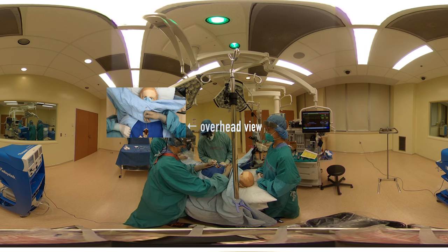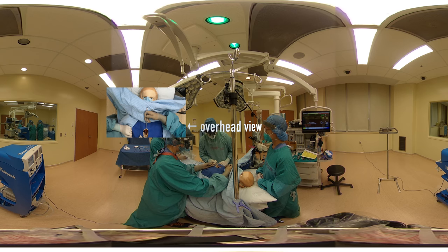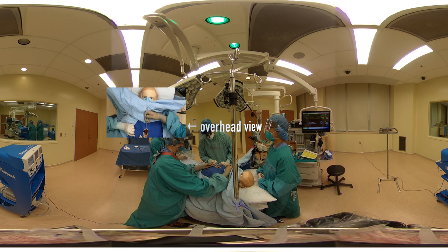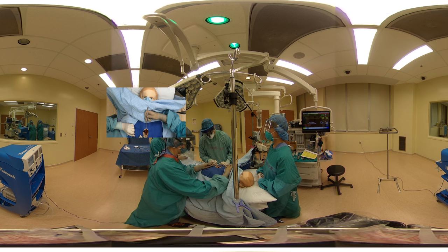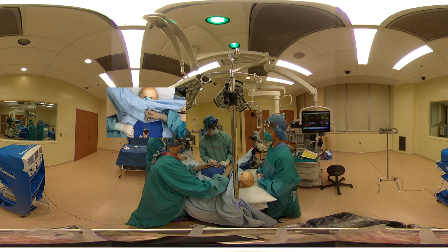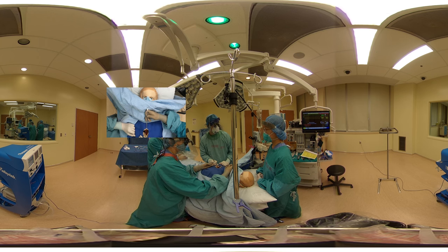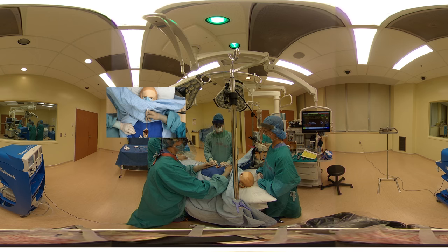We've finished our dissection and have the trachea exposed. However, there are some concerns — this is a bit of a deep neck with possibly some abnormal anatomy. Putting the tube in could be challenging, and I wouldn't feel comfortable doing it with a paralyzed patient. So I think we should keep the patient breathing spontaneously. Shall we move to Plan B? Yes, let's do that.